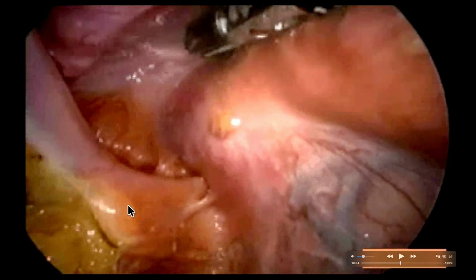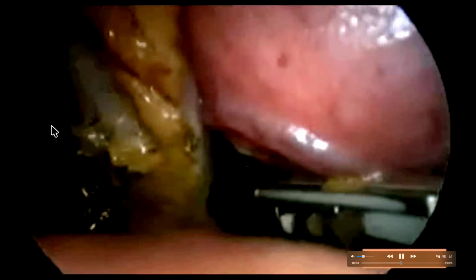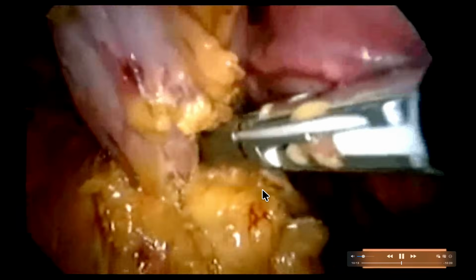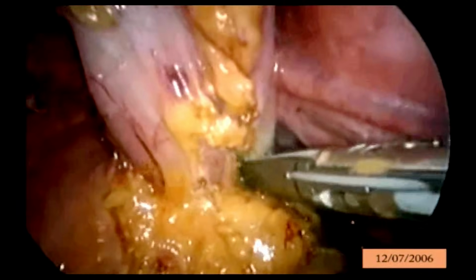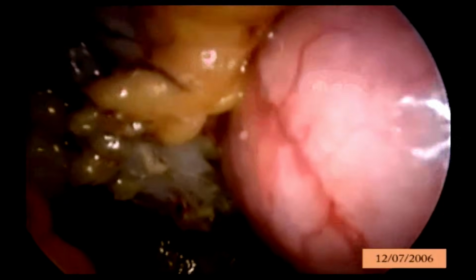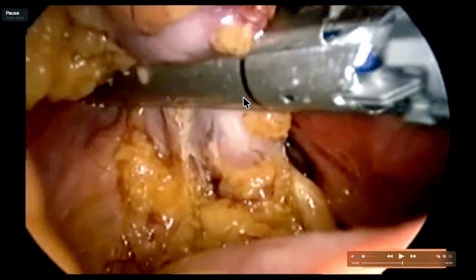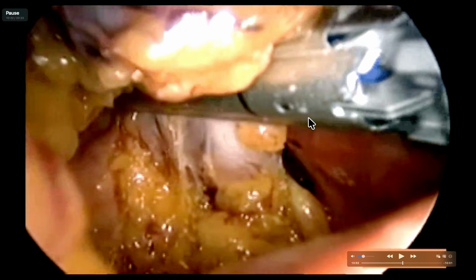Here the uterus is lifted, and this is the rectum going into the cul-de-sac. And now the skeletonization process is complete. We cannot see any fat at that junction of the staple line. Then you will use a blue cartridge, and you will rotate and articulate your stapler. That's why staplers are called roticulated. So this is the stapler. You can see the blue cartridge, and it is fired.